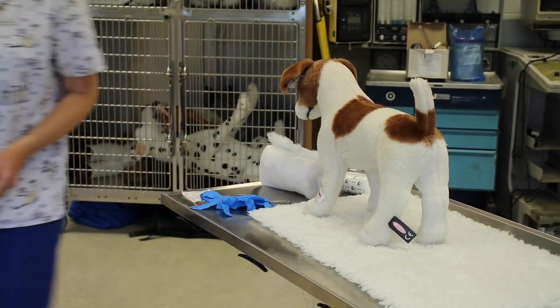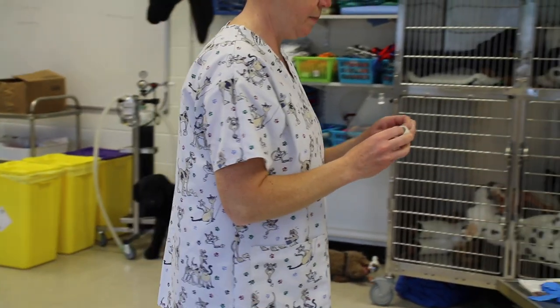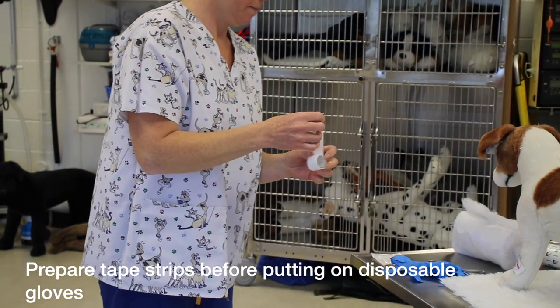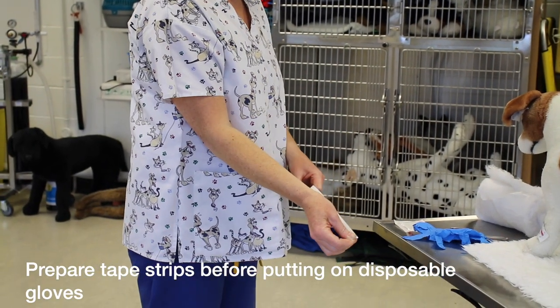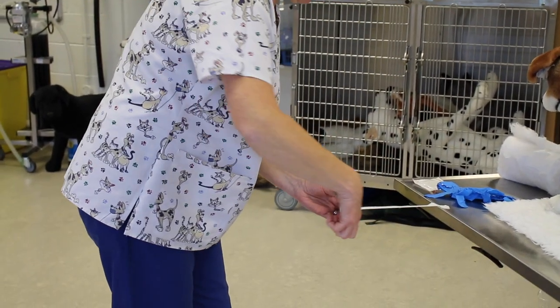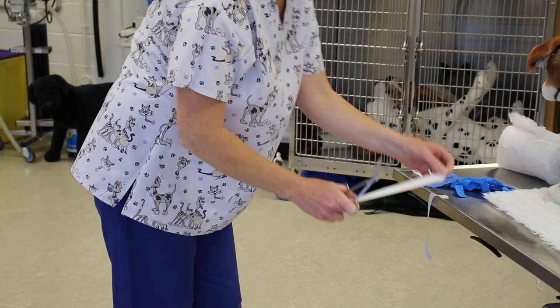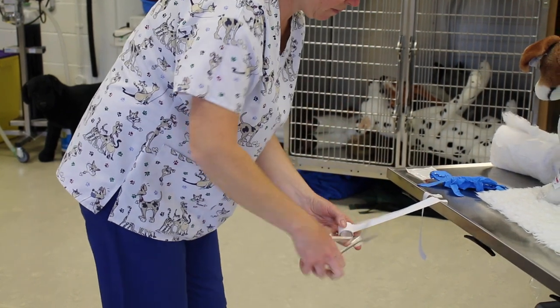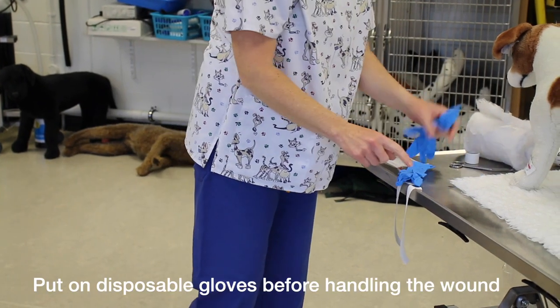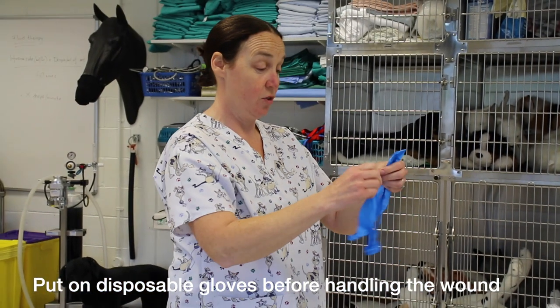This one also needs some zinc oxide tape, because we need to stabilise the splint in place. So we're going to cut two strips. It's wiser to get your strips ready before you put on your gloves, because the tape would stick to your gloves.